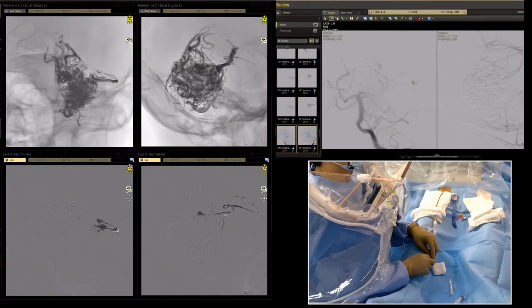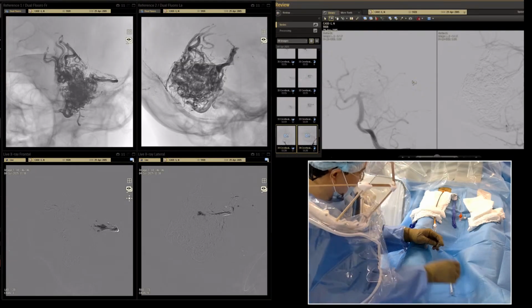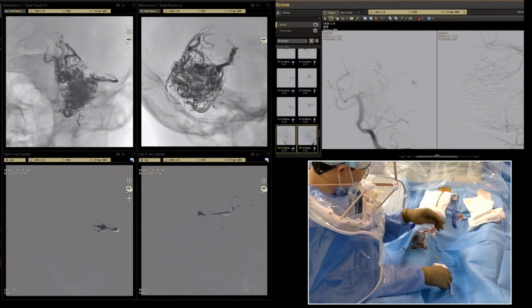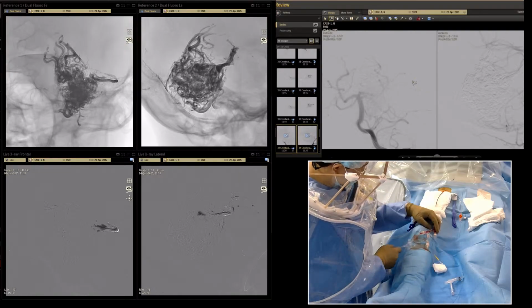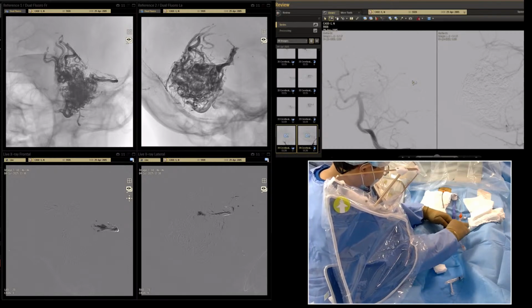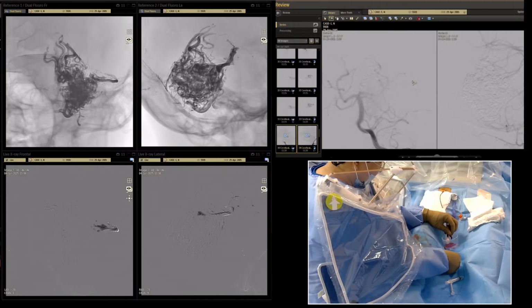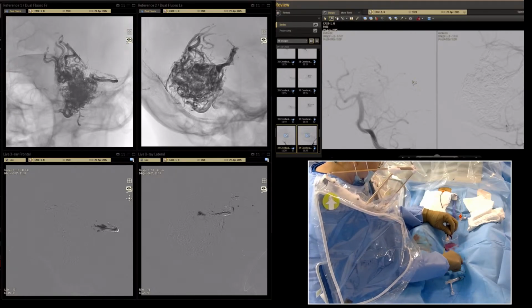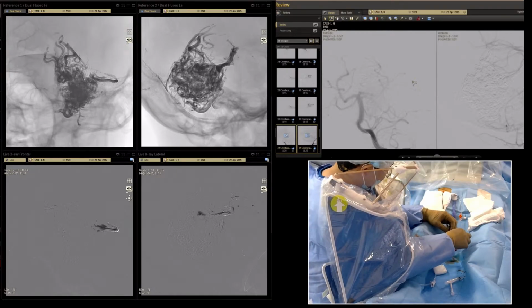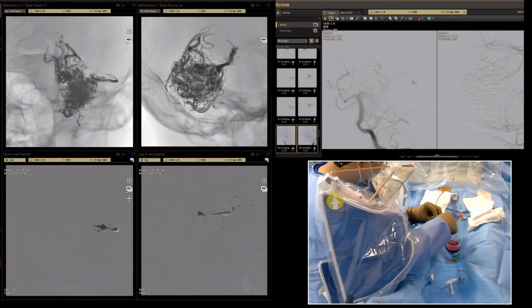Okay. That's the control. As I compressed the system a little bit, it's better to take it like this. It's so-called endovascular hijama.